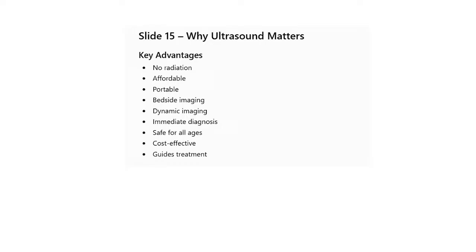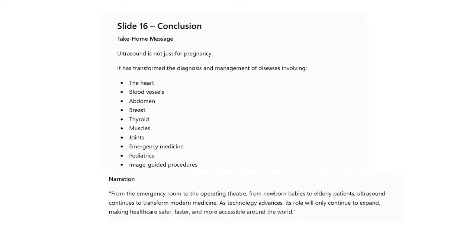So now, why does ultrasound matter? The key advantages: no radiation, affordable, portable, bedside imaging, dynamic imaging, immediate diagnosis, safe for all ages, and cost effective. It also guides treatment.